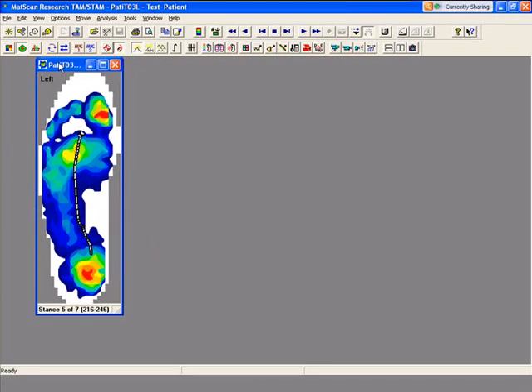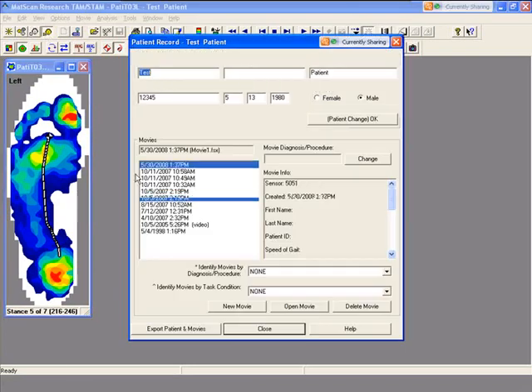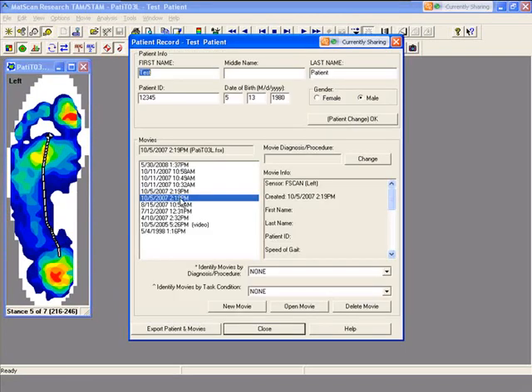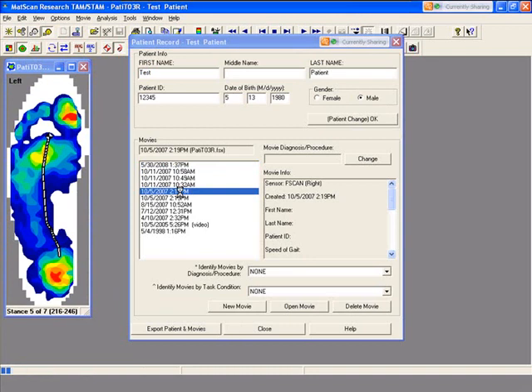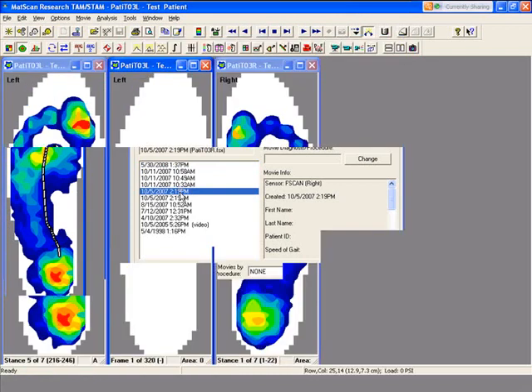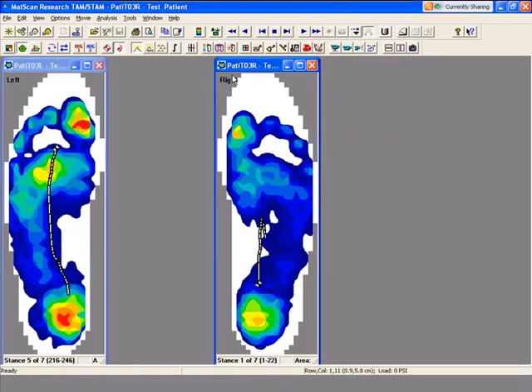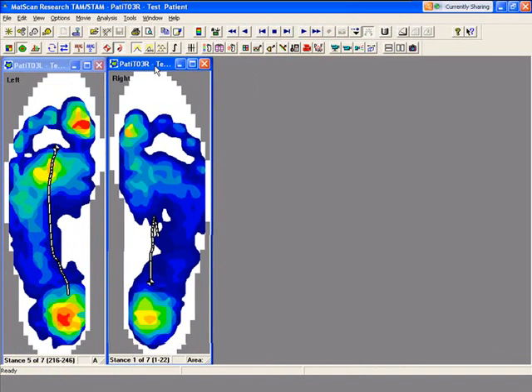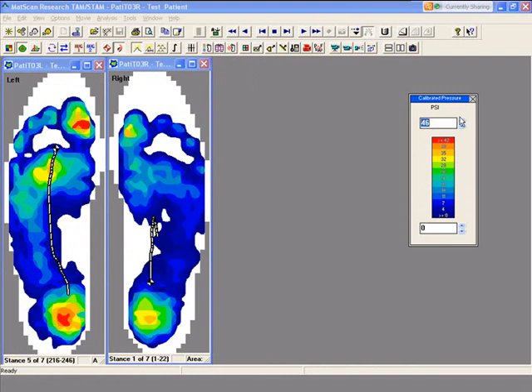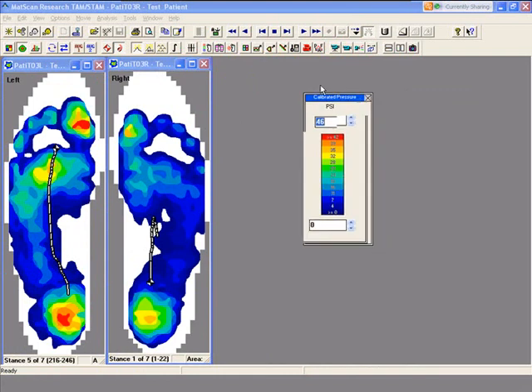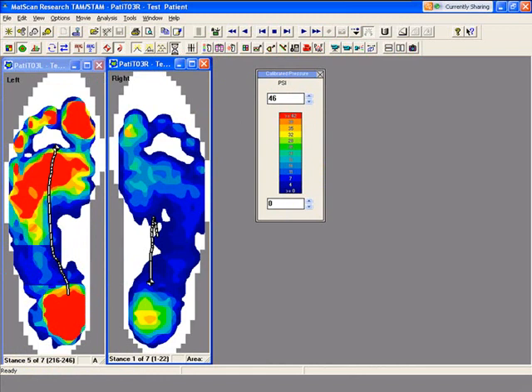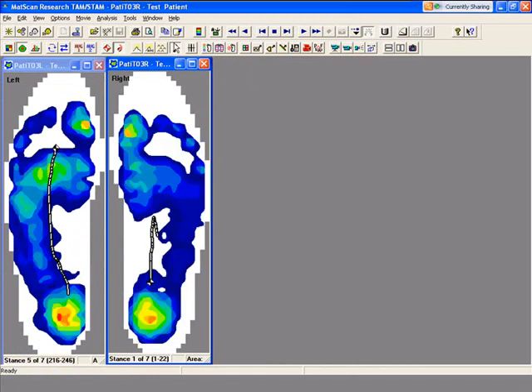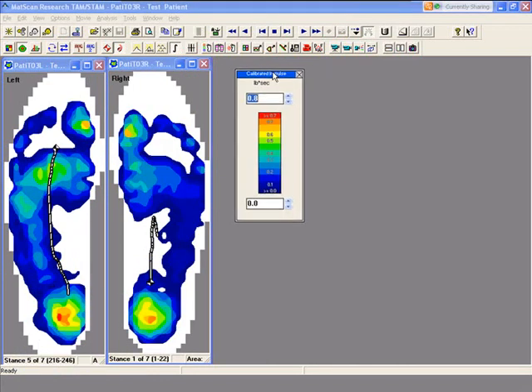Now we're going to look at integral impulse. What integral impulse does is it takes into consideration timing as well as force. If we look at the color legend right now, it's in psi, but if we click on integral impulse, it'll change. Now it's in pounds by seconds.